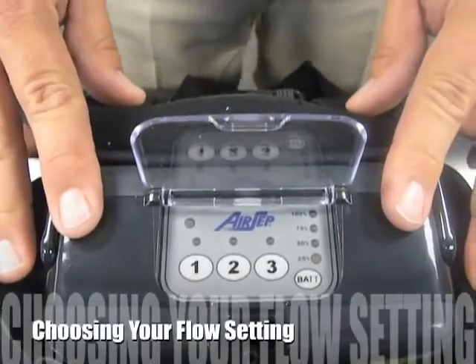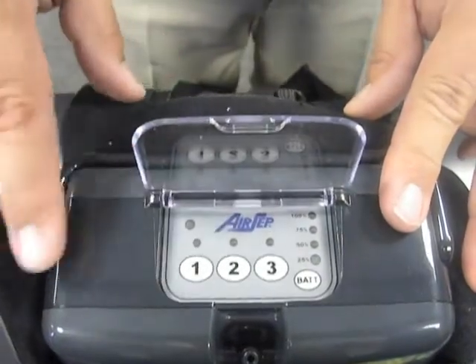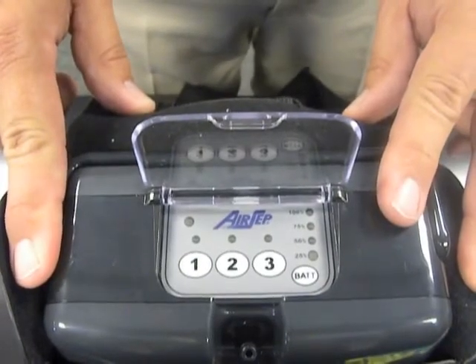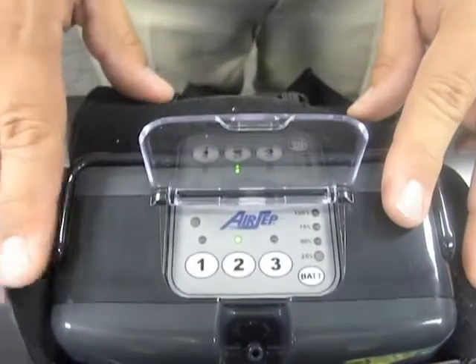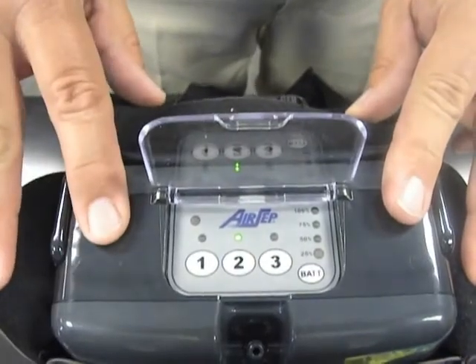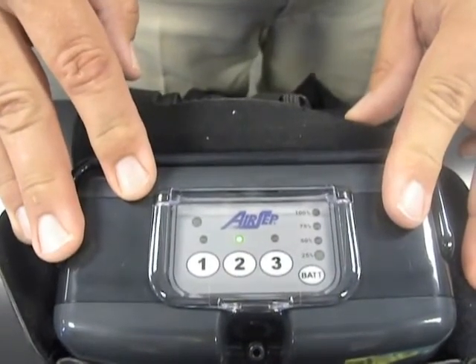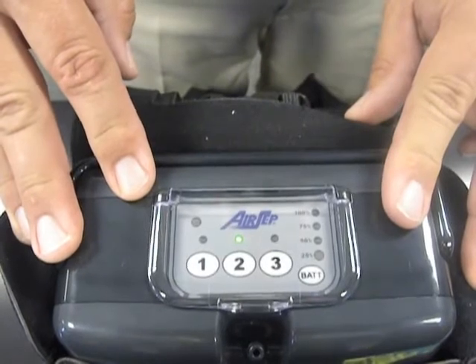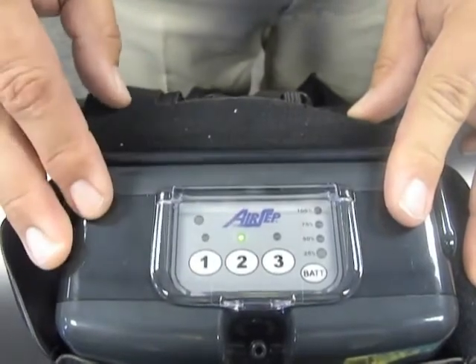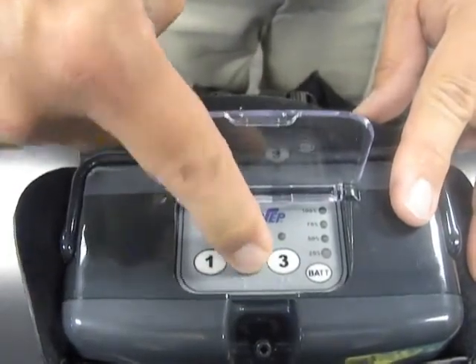To operate the Freestyle portable oxygen concentrator, you would select the button that has been chosen by your physician. There are three different flow settings available on the Freestyle 3. If your prescription is a setting of 2, you would simply press button number 2 to start the Freestyle. You will see a light illuminated directly above the 2 position. When the device delivers a pulse of oxygen, that green light will blink letting you know oxygen has been delivered. When you are done, you can simply press the button once again to shut the device off.